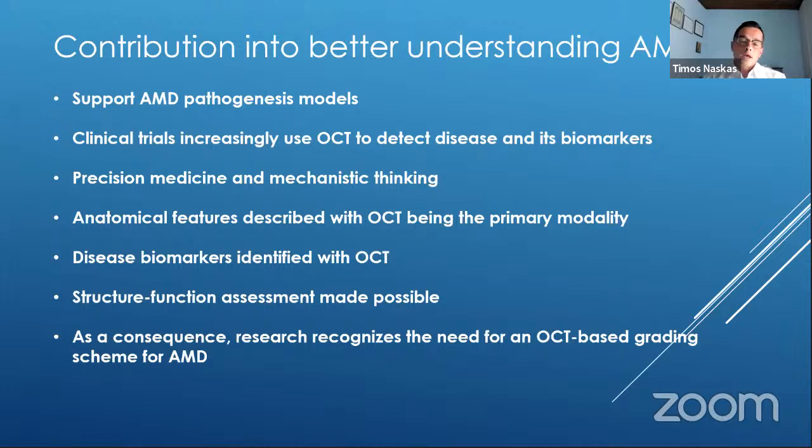And as I said earlier, the field of research still formally recognizes the need to develop an OCT grading system for AMD. So there is a good place to develop this, since there are many research groups working on it. A very important and famous research group is Cynthia Stoff's, which works a lot on OCT and AMD as well. I think they are on the way to applying a new classification system, but they are still holding back on some publications from that.